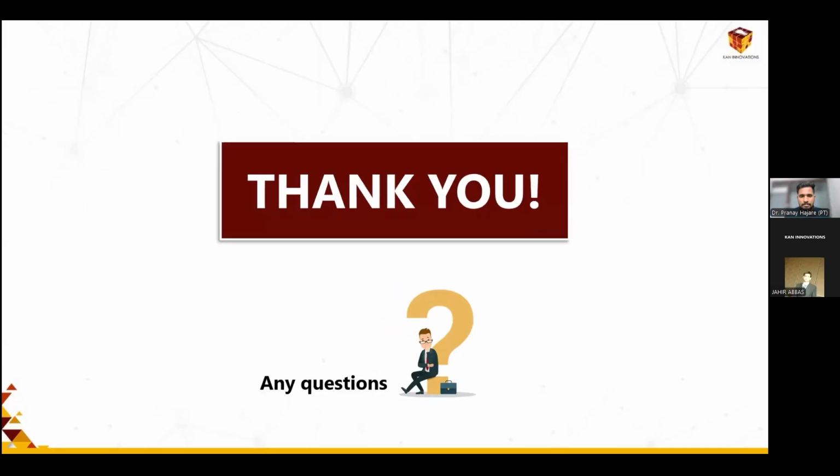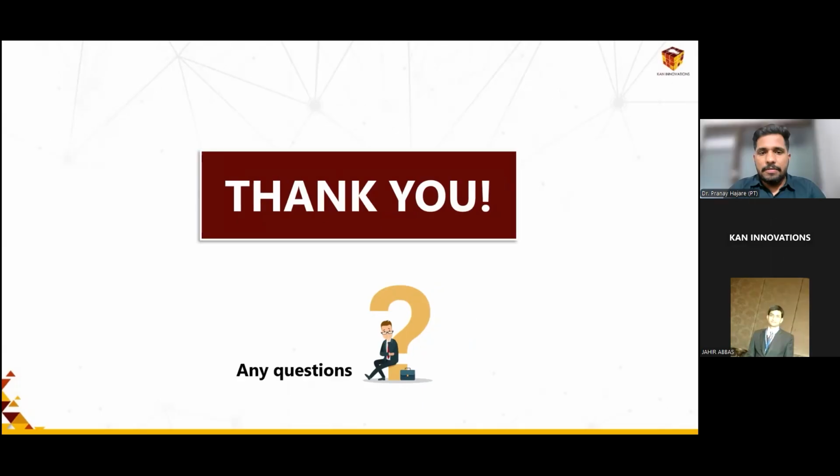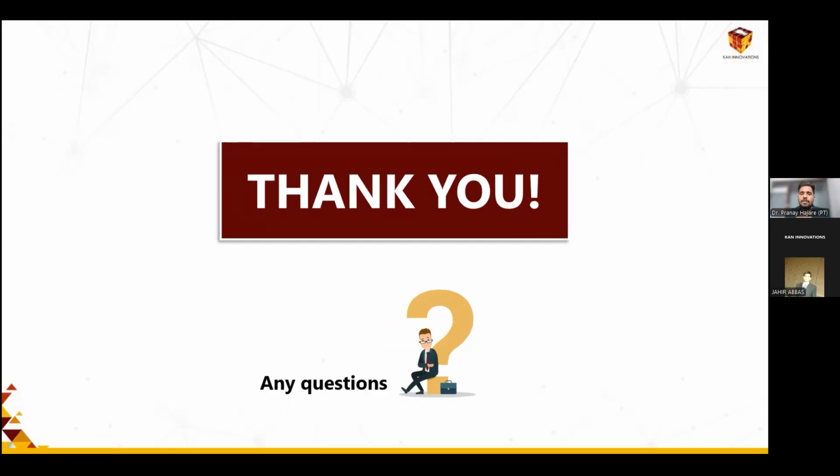We have a question from Dr. Sudhanshu Kumar. He is asking for the normal value of arch index. Yeah. So the normal value for the arch index is 0.21 to 0.25. If the value is increasing more than 0.25, that indicates that the midfoot arch collapse is more. The midfoot is getting more contact with the plantar pressure system, which suggests the medial longitudinal arch is more involved. So that indicates the pes planus condition, and vice versa for the pes cavus condition.